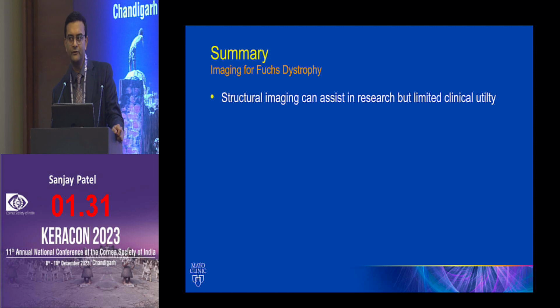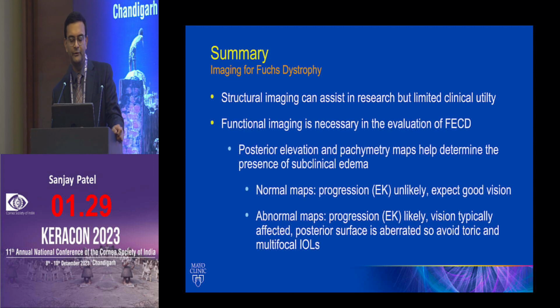So again, structural imaging, I think great for research, but functional imaging, I think, is really becoming a standard of care. It's more helpful than getting endothelial images, and can really help you with decision making, and predicting vision and what you should do for these patients.